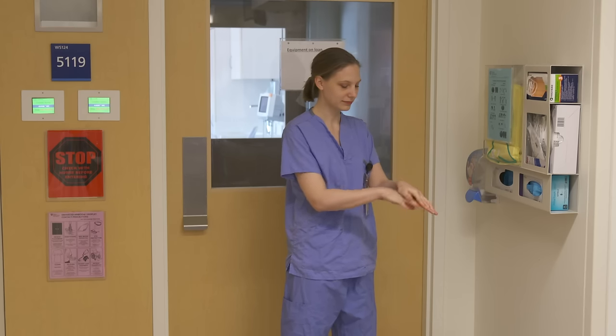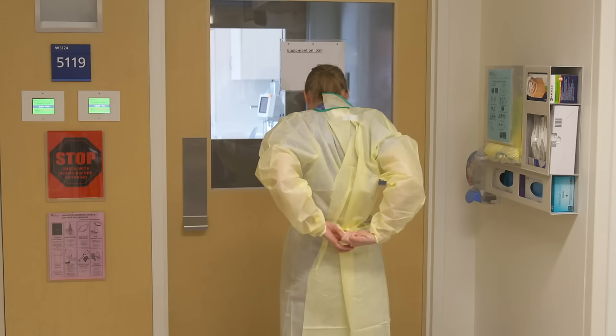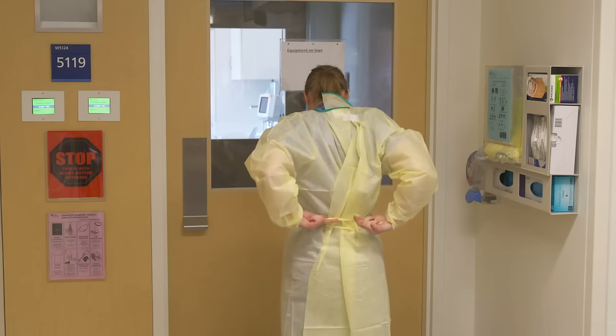Use soap and water when hands are visibly soiled. Don your gown by first closing the back of the neck. Tie the waist, ensuring all clothing is covered.